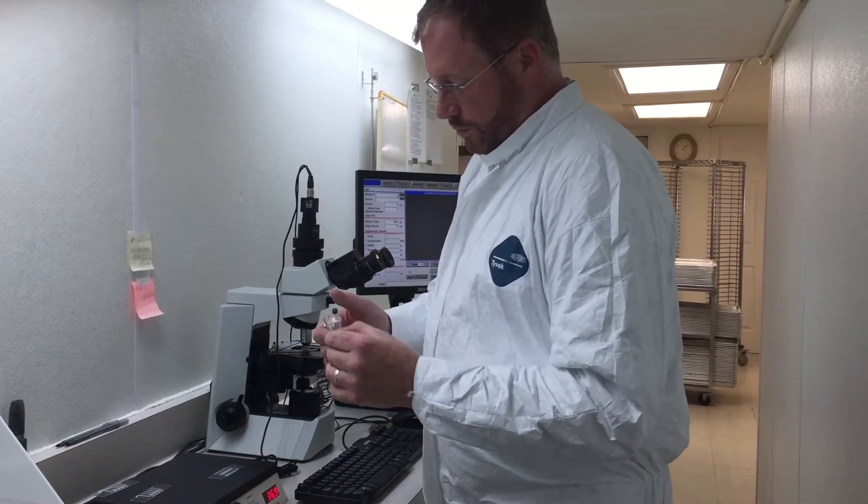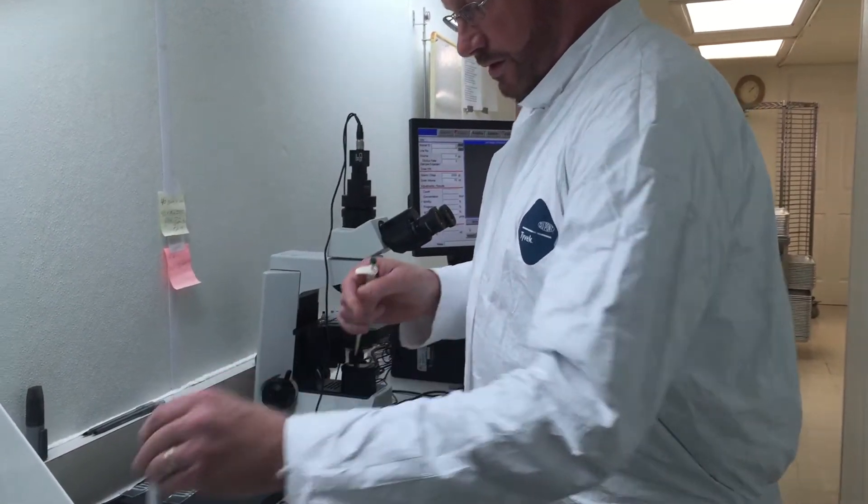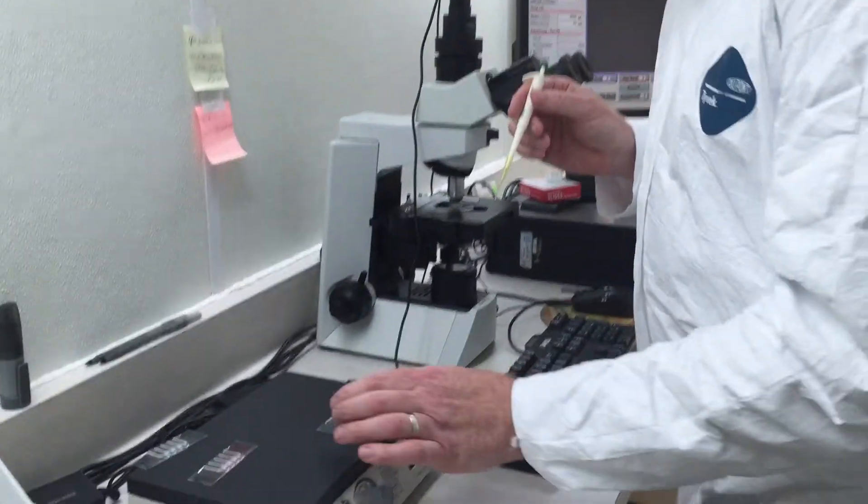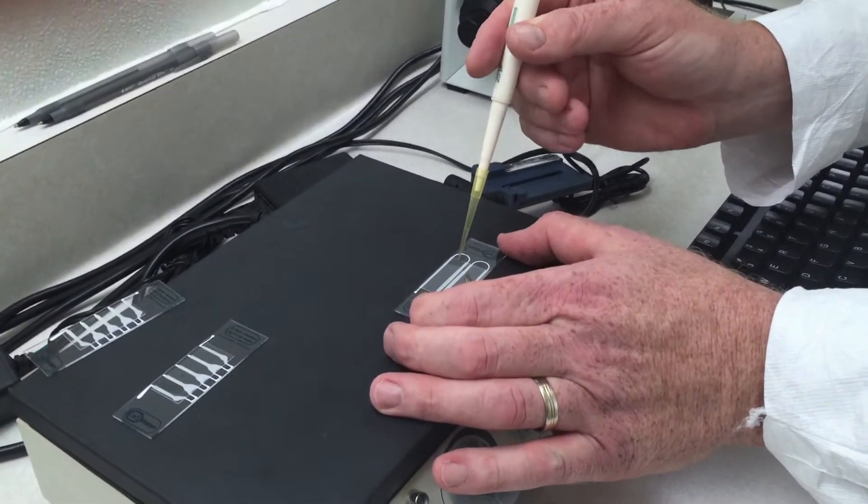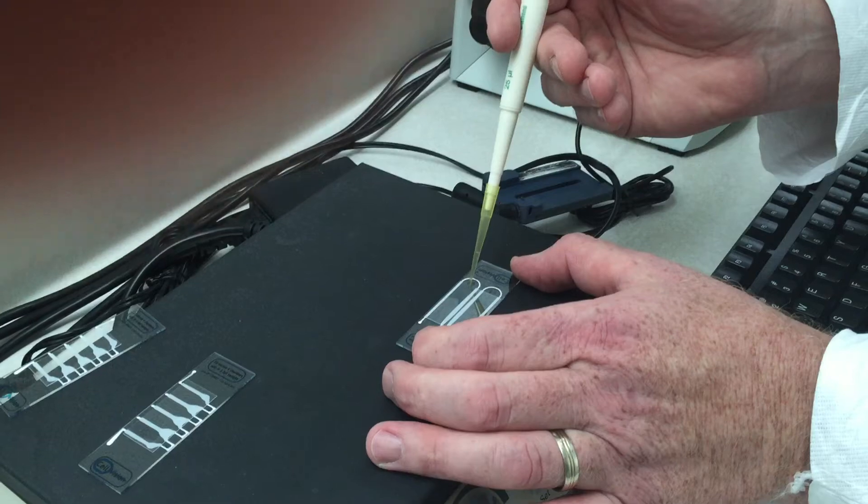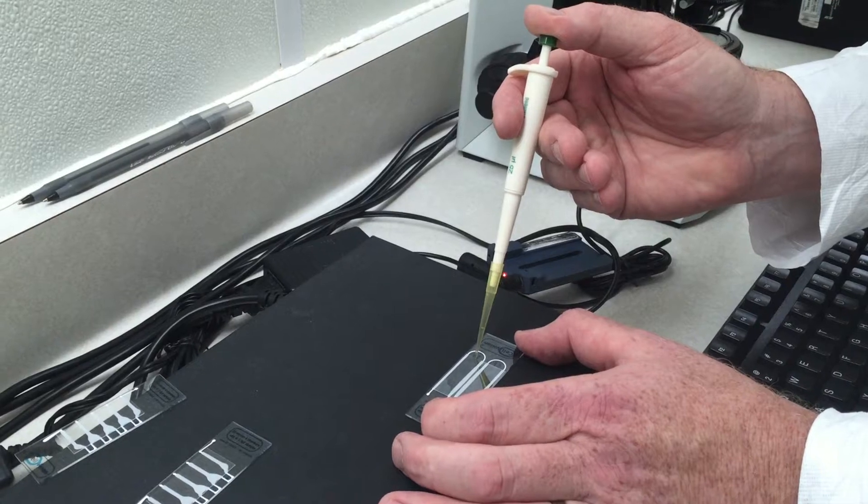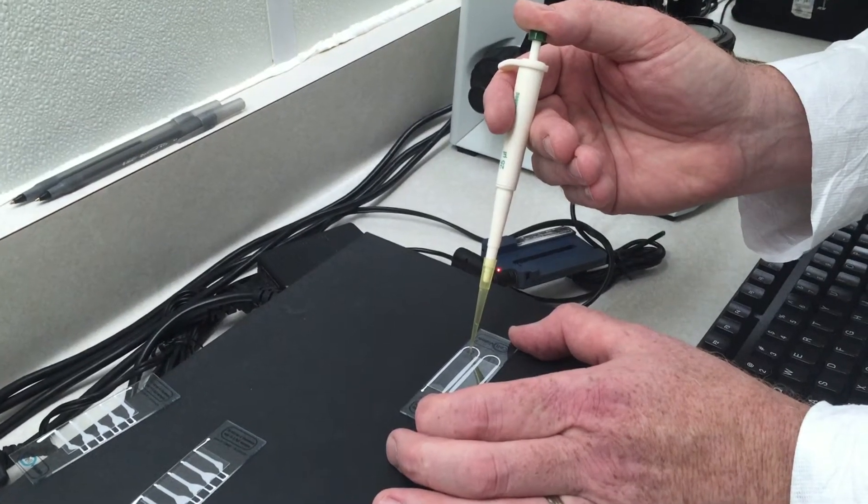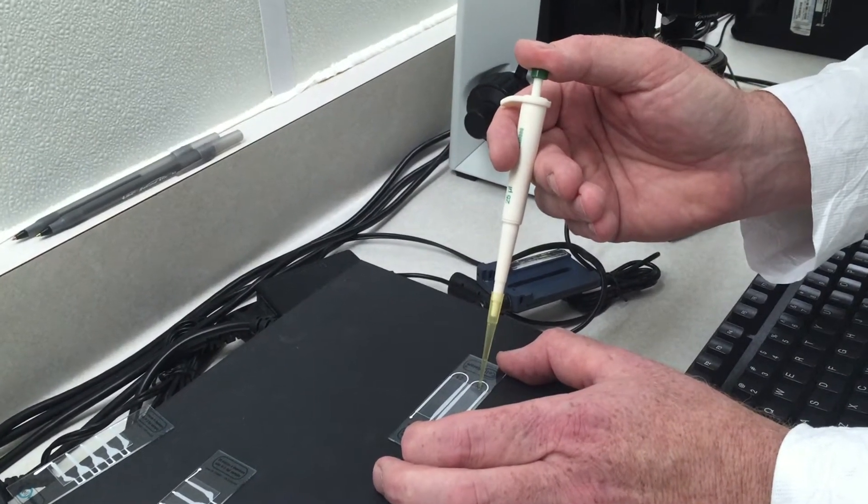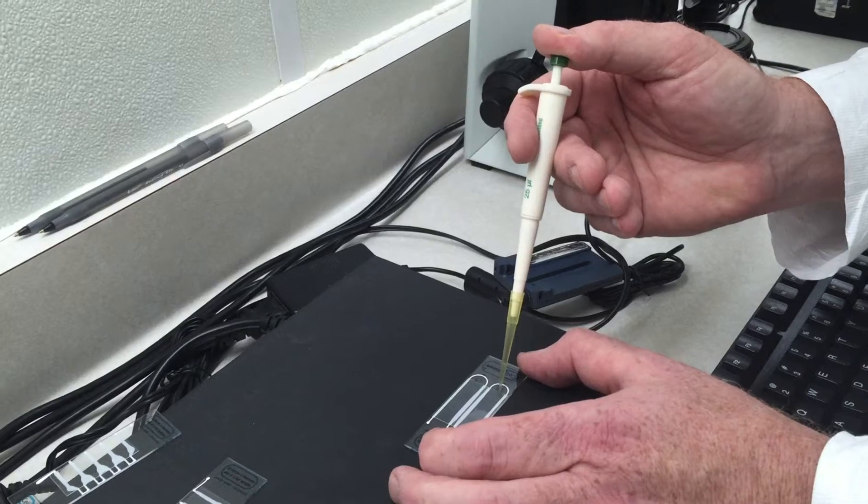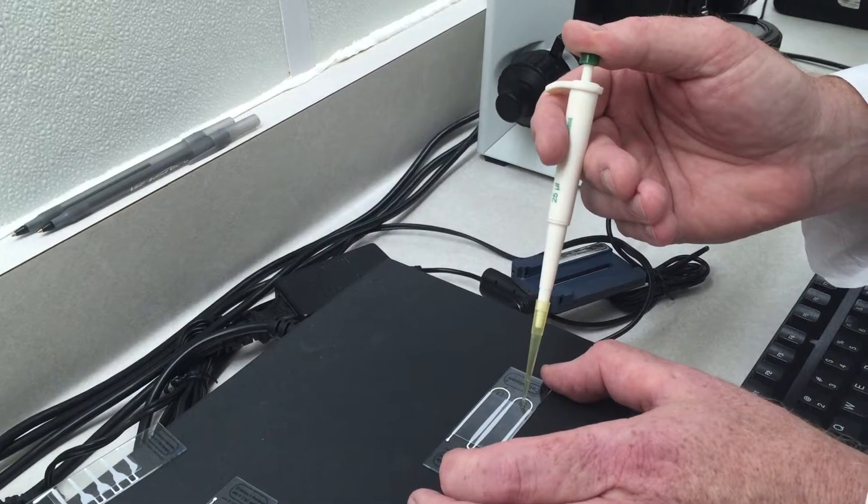So we're stirring our sample, removing the top, and pipetting one pipette full. Now we're going to load both chambers of the Cell Vision slide because we want to do at least two samples to get an accurate count. Here's how we load: we put a small amount right at the start and it fills by capillary action. Go until the chamber's full, and we'll load the second chamber as well.